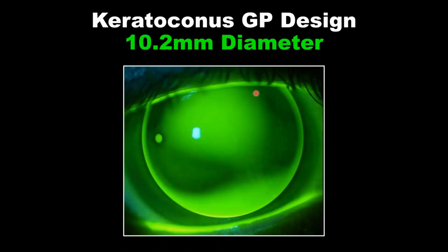So for this patient with 258 microns of sagittal differential, a KBA lens, a lens designed in Australia, was actually a great fit for this patient. And that was because we weren't managing a severe amount of asymmetry. But as that goes up, we're going to need to consider dealing with larger diameter lens, maybe a scleral, piggyback, something other than possibly the GP on its own.